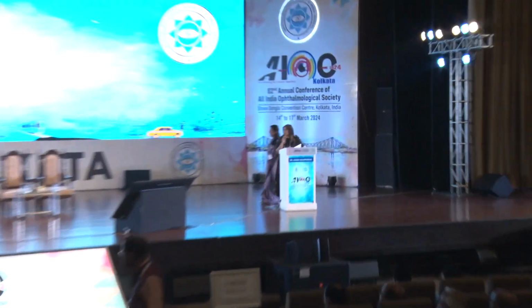We have a very interesting course on posterior capsule rupture and IOL implantation that we are going to begin soon. These will be some real challenging cases that we happen to meet in our ORs, and we need to have some sort of patience to deal with these kind of cases, because many times it's an unexpected turn of events that happens in the OR, and then you are often caught by surprise. But the point is that the mindset of the surgeon should be all set, and we should be ready to handle any situation that comes.